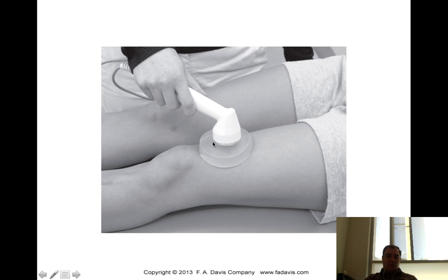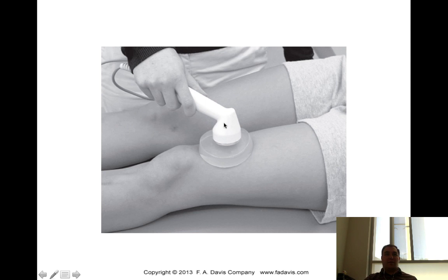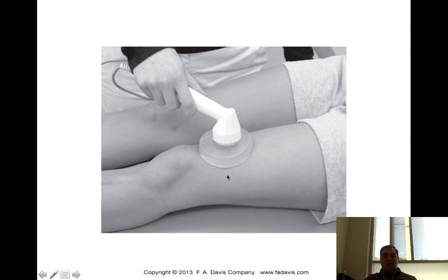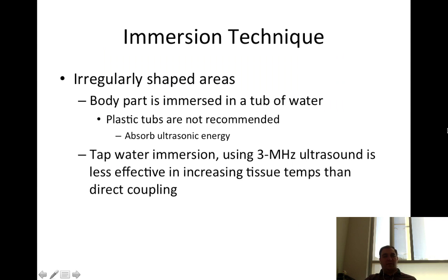This is an old-school gel pad that nobody uses anymore. The ultrasound wave would have to travel through three or four inches of gel pad and then into the skin, so it's not as effective. Using it on the quad makes no sense. The immersion technique is better for irregularly shaped areas.